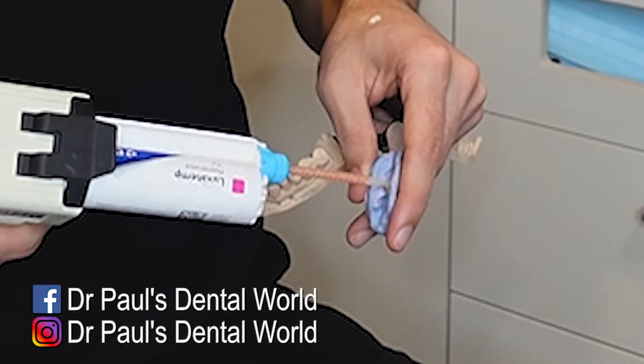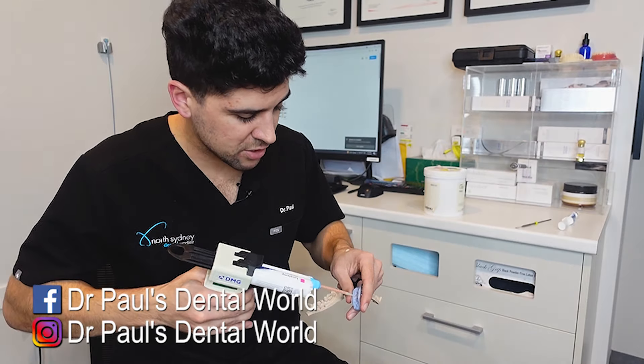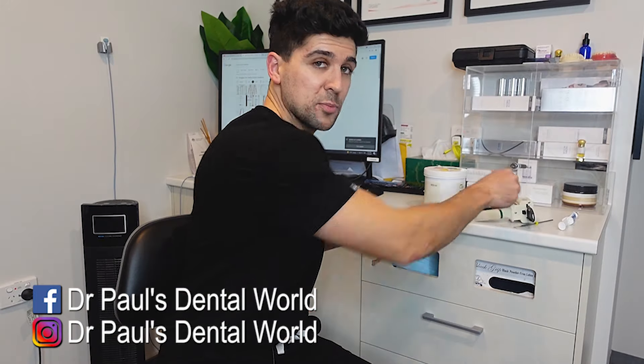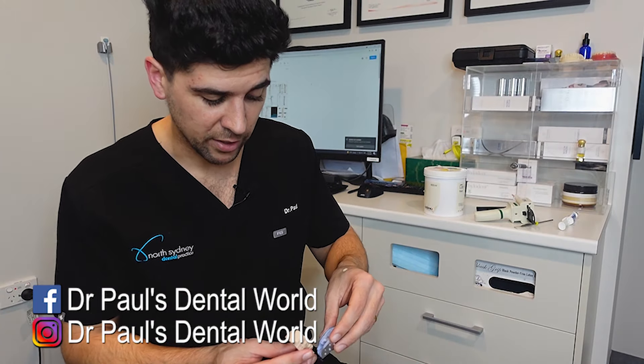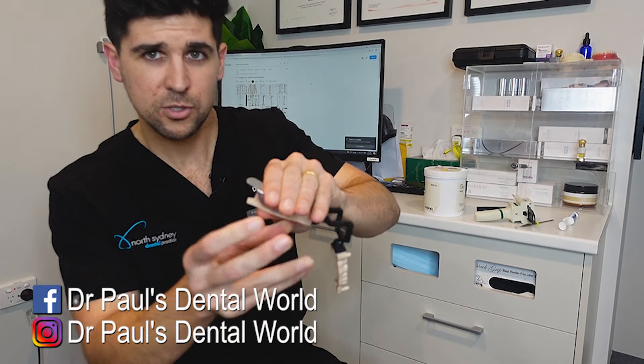Now, in the mouth, I'm going to show you a slightly different variation just to help capture subgingival margins. But this one, I'm just putting it straight in here, nothing onto the tooth. And I always put more than I need to — I prefer to have excess. We're going to line it up over the top and squish it into place.